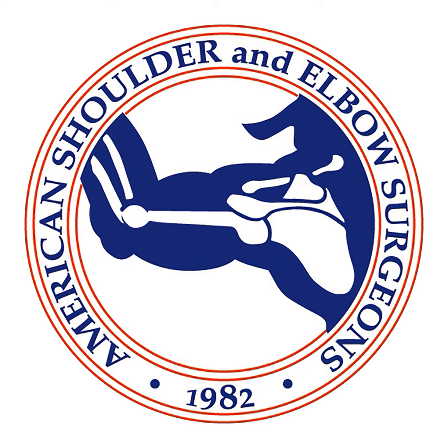Yeah, and there's one patch on the market right now that has stretchy, kind of elastic properties, and I wonder if something like that might be kind of the correct path, because then it can stretch a little bit, so it's sharing the load with the tendon. But if the tendon gets stretched to a certain point, then maybe that picks up the slack. I don't know, but I think that's an interesting concept.